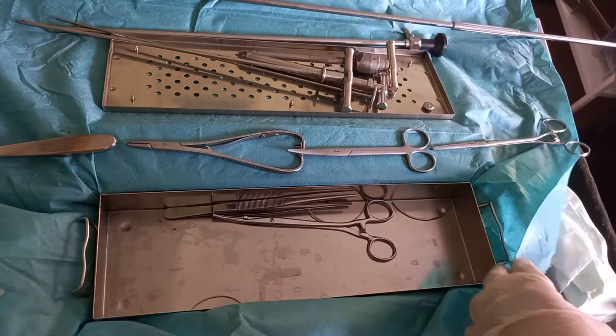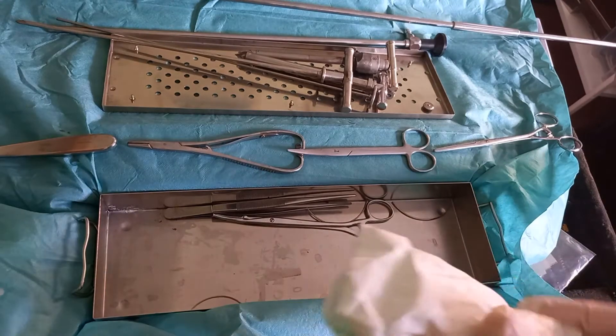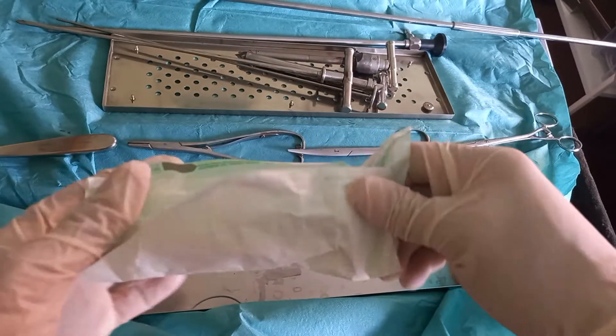A gauze bandage roll will be used as the toggle for the purpose of fixation of the abomasum from the outside.